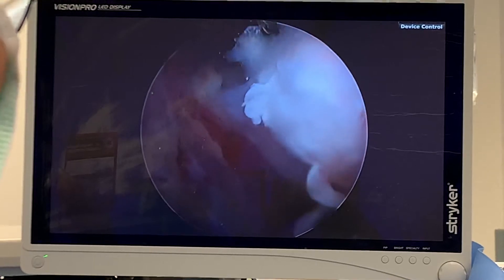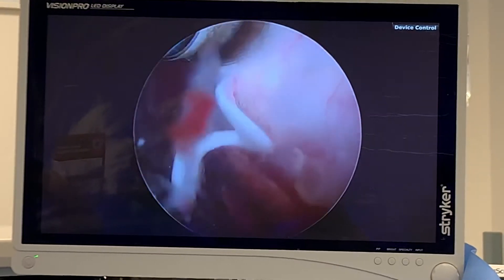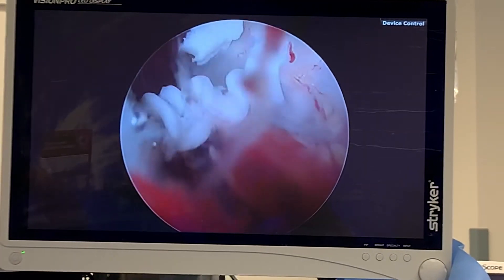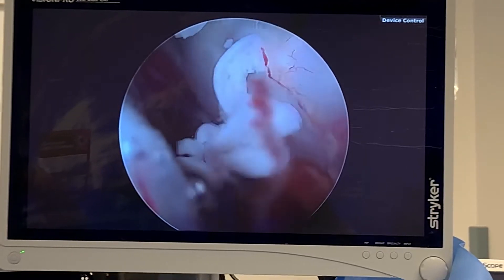Maybe just put a bigger tool that will probably compress a little bit better. I'm going to go like this. See that — calcific tendonitis.